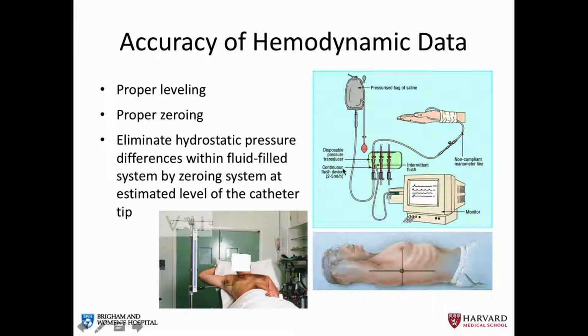It's also important to know that this catheter system is not simply an intravenous catheter, but it's a non-compliant manometer line that's actually designed for high-pressure systems.